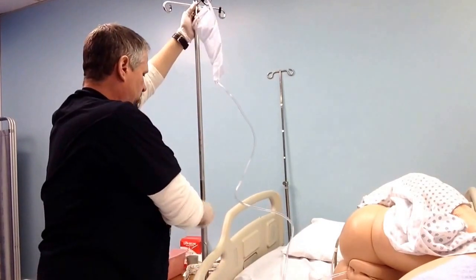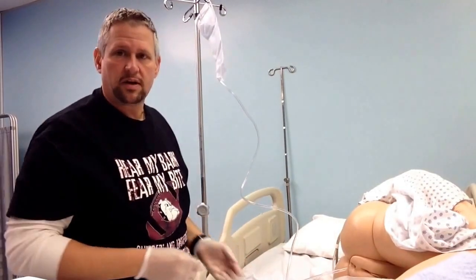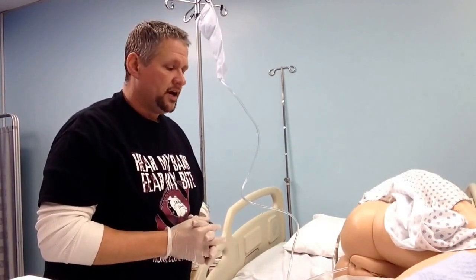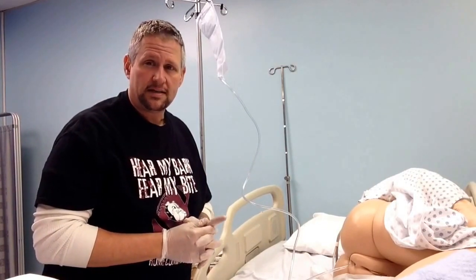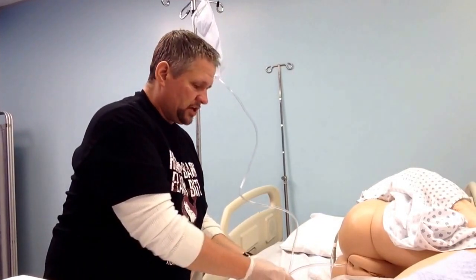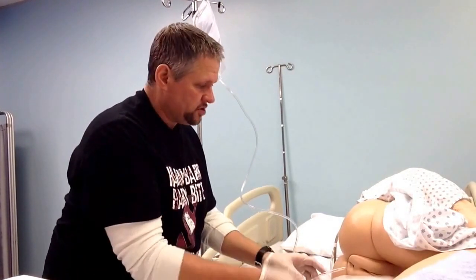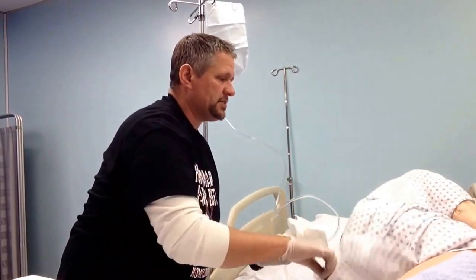We're going to allow the enema to enter into the patient. We're going to make sure the patient's able to tolerate it. We want to encourage the patient to be able to hold this for 5 to at least 15 minutes if they can tolerate it. Once the amount of enema is in, we're going to close it off. We're going to remove it. We're going to give the patient some tissue and allow him to clean himself.